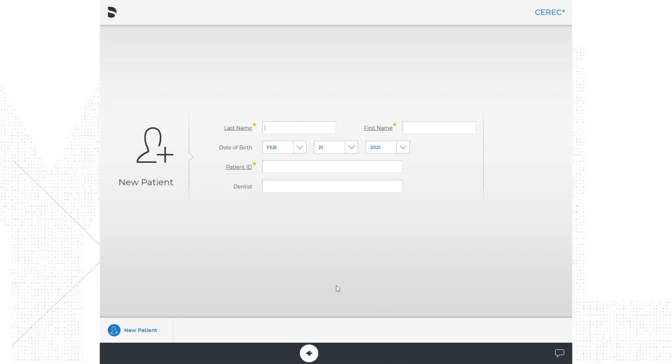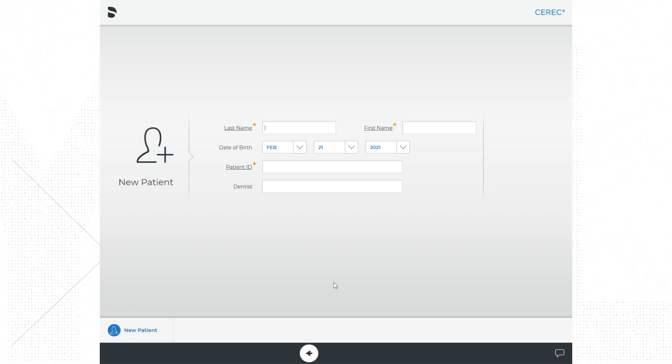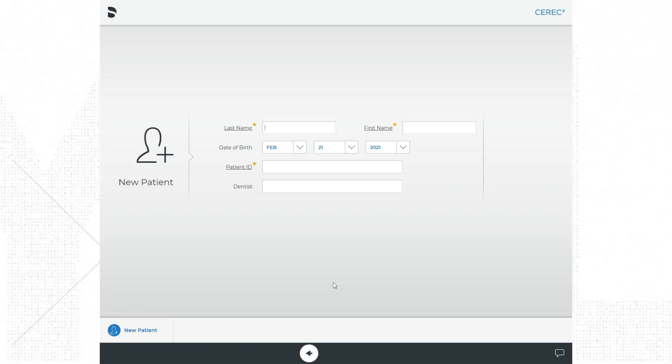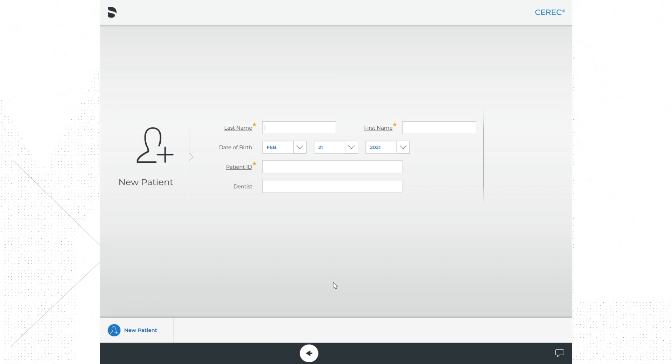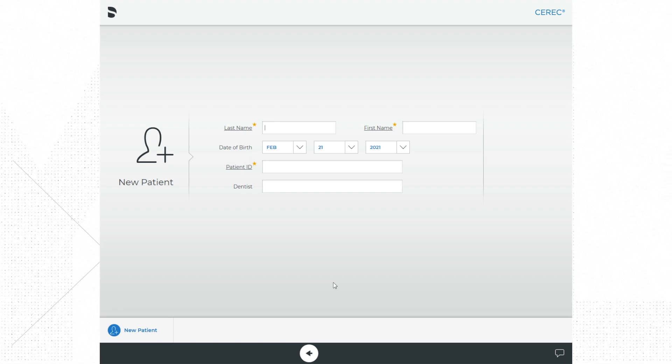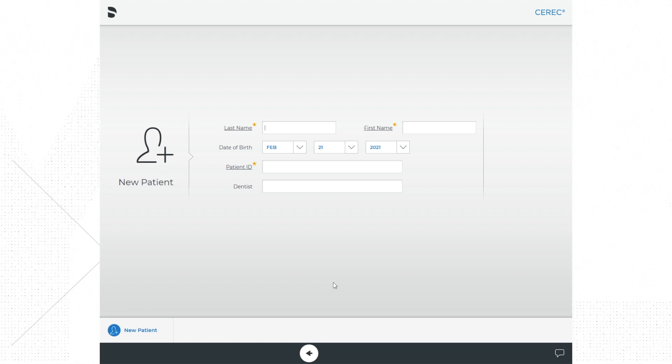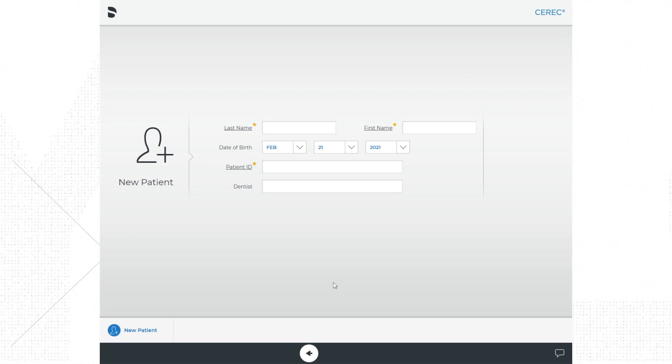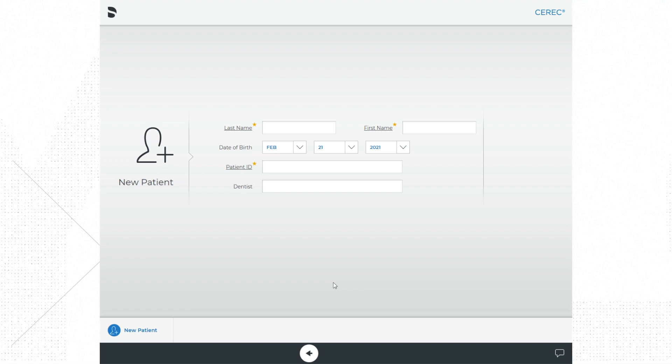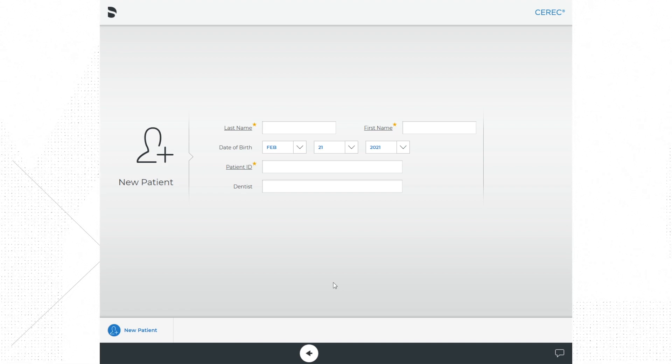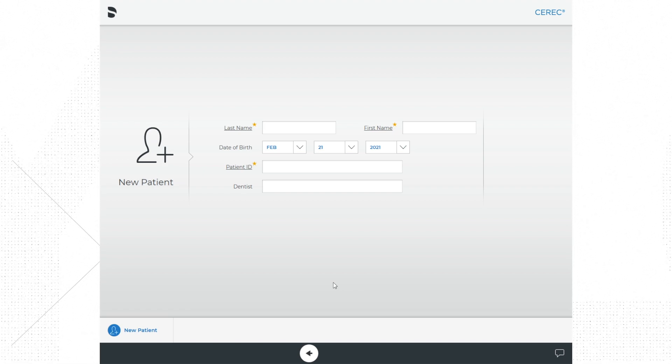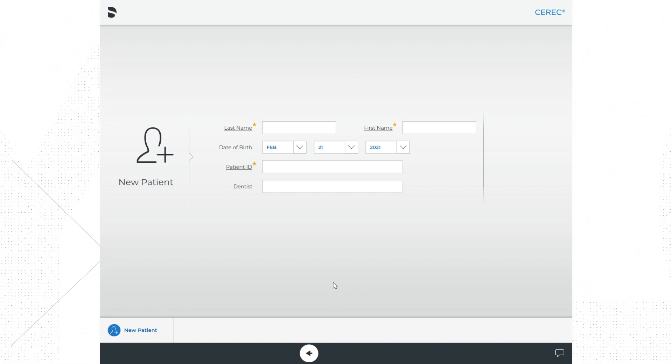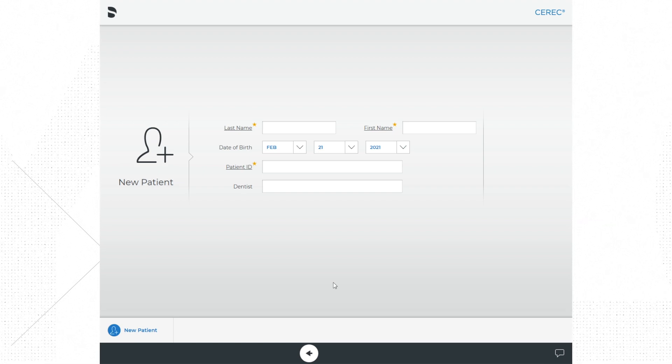Next you are going to see a screen that asks you for information about the patient. Here you will enter the patient's last name, first name, and date of birth. For the patient ID, you can enter the social security number or any number that you like. I usually just enter the last four of the patient's social security number.